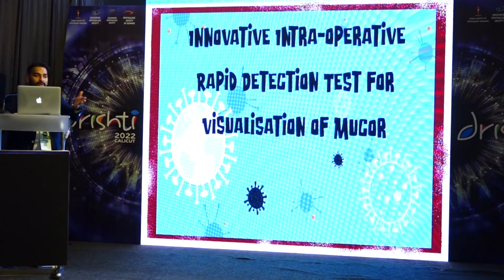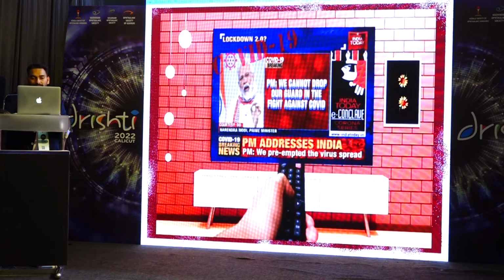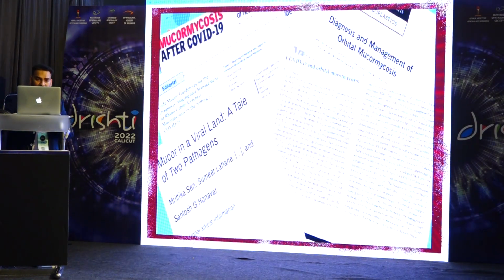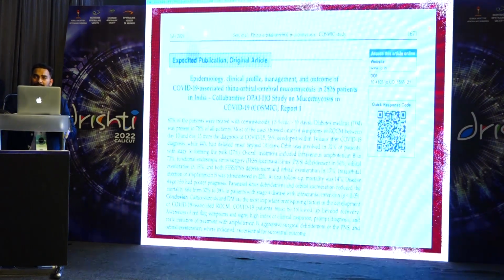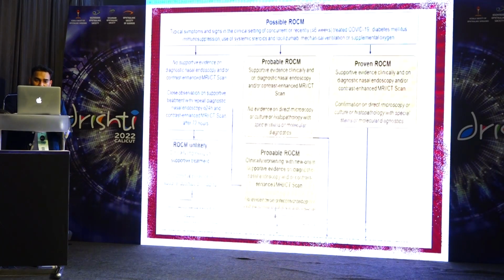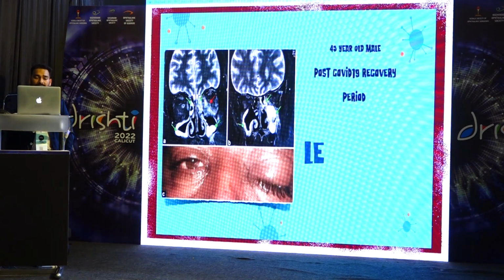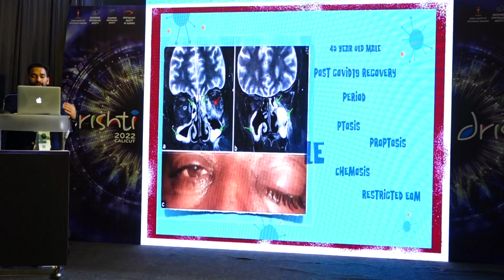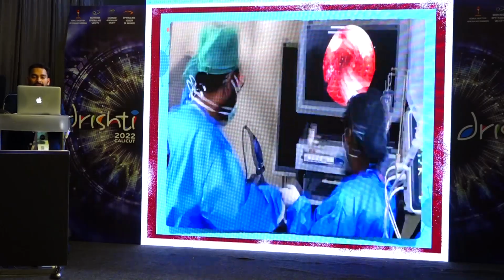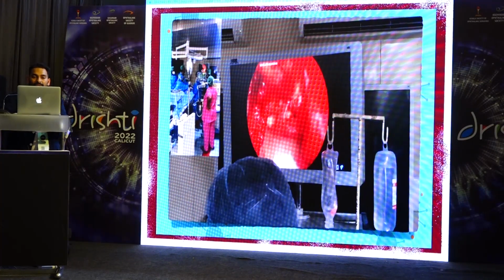What happened is, my dear friend Dr. Prasanna had called me during the COVID time. It was a very crucial time when COVID-19 and mucormycosis were spreading, and there is a lot of literature on mucormycosis and also ROCM. We needed extensive debridement in the paranasal sinuses. The ENT surgeon needs to find out whether the debrided area has the fungus or not. So he called me and asked if my IOLSCOPE can detect the fungal hyphae. I said, why not, we could try that.